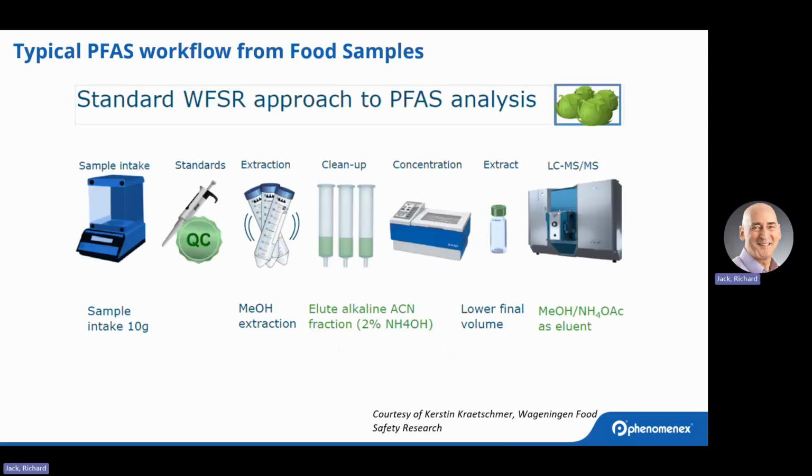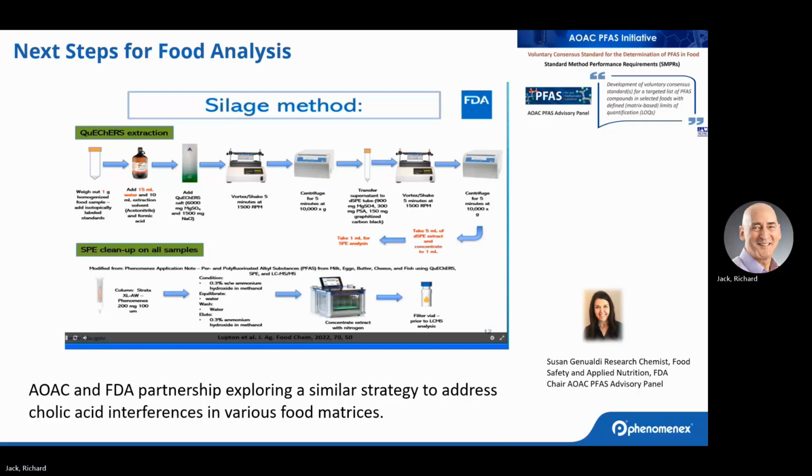Switching now to food, for a typical PFAS extraction, there is spiking of standards, extraction, cleanup, and so on and so forth. A similar approach is used, except there's a QuEChERS extraction step, typically not done for environmental samples. And this has been well documented.